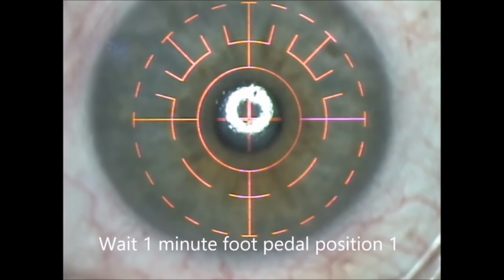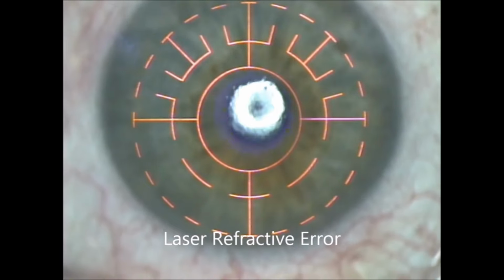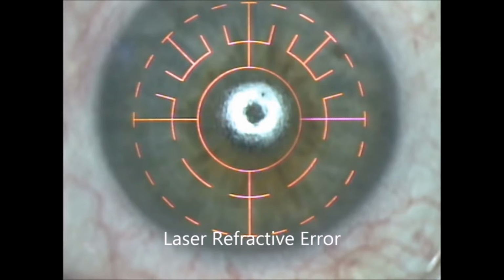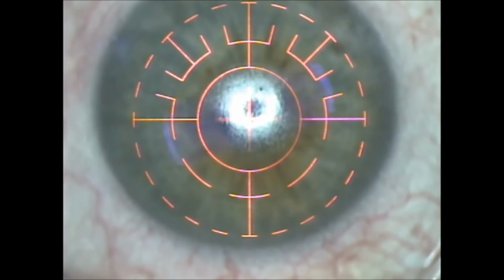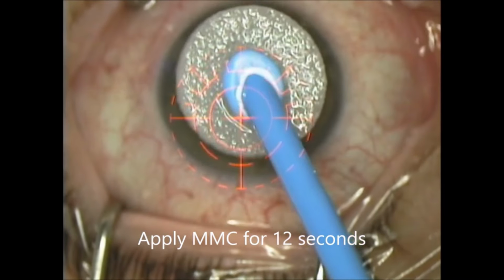Following this, I wait 1 minute in foot pedal position 1, allowing the surface to dry prior to the refractive treatment. They're usually low refractive errors, and we laser the stroma without having any additional touching of the stroma itself in between the PTK mode and the actual laser mode. I do apply mitomycin C for 12 seconds. This is what I typically do in PRK, so I tend to do it in these patients as well.